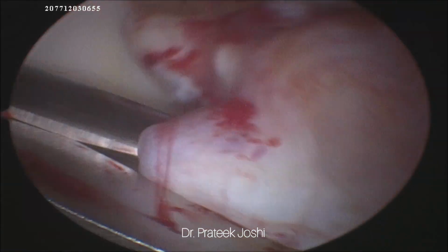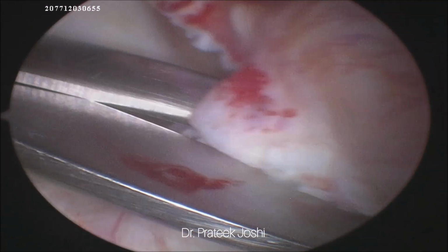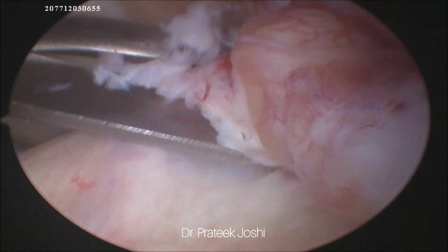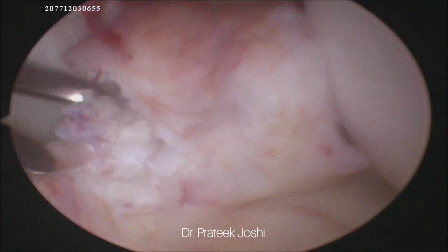So now I am going to remove the tibial stump of the ACL and you can see that I am gradually removing the remnant of the ACL in order to visualize the ACL tibial and femoral footprint.